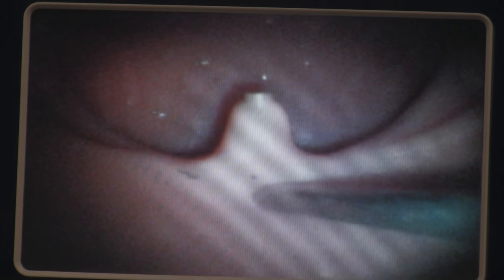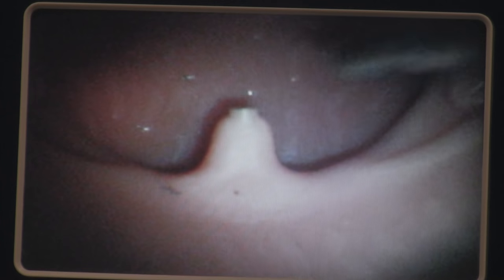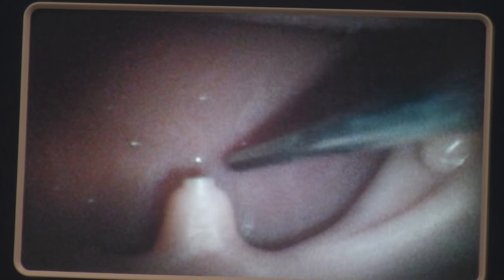You can see there's the patient's nose, lips, and teeth. As we go midline, you can see the hard palate right over here. Right behind the hard palate is the soft palate, and just below that is the uvula and the palatoglossal arches. Behind that there's the pharynx — this is the posterior wall of the oropharynx.